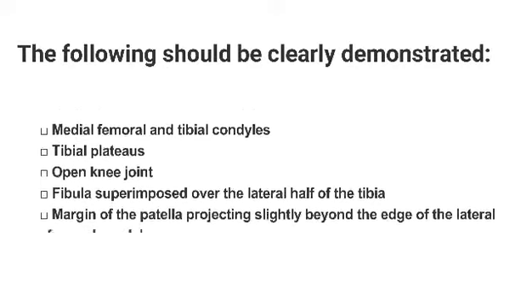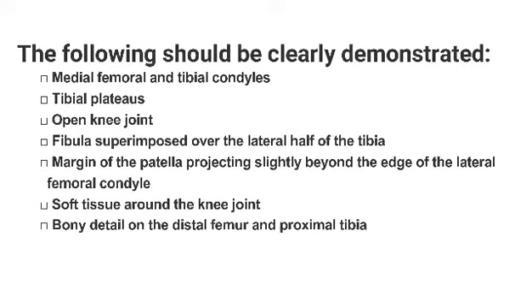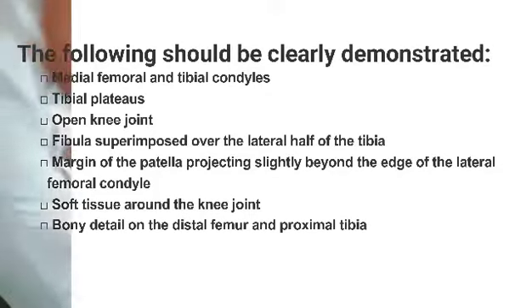Medial femoral and tibial condyles, tibial plateaus, open knee joint, fibula superimposed over the lateral half of the tibia, margin of the patella projected slightly beyond the edge of the lateral femoral condyle, soft tissue around the knee joint, bony detail on the distal femur and proximal tibia.